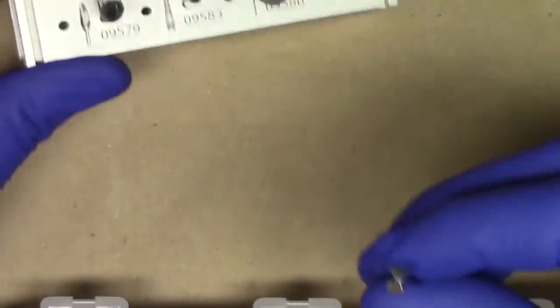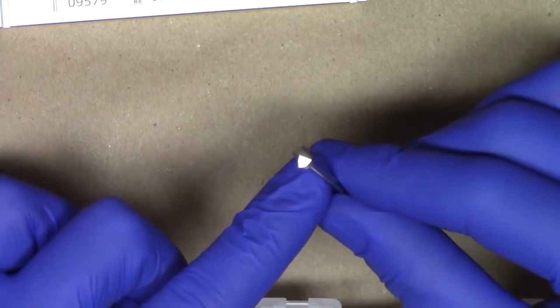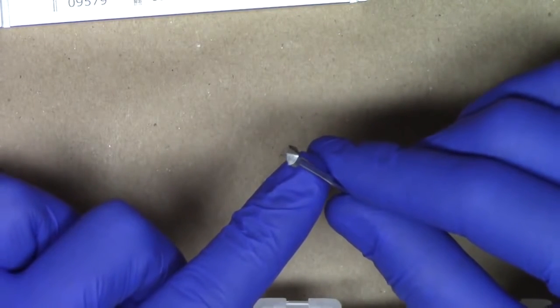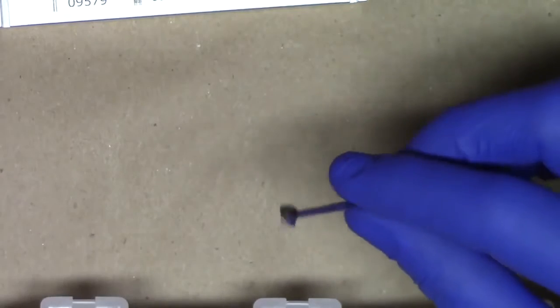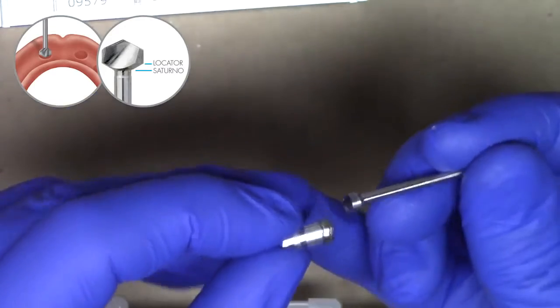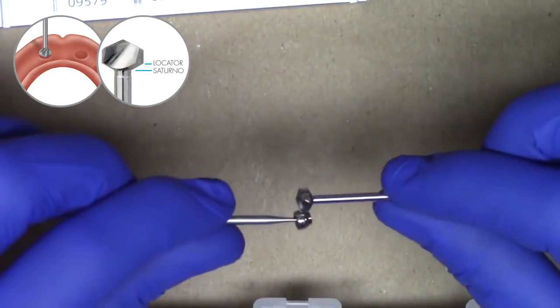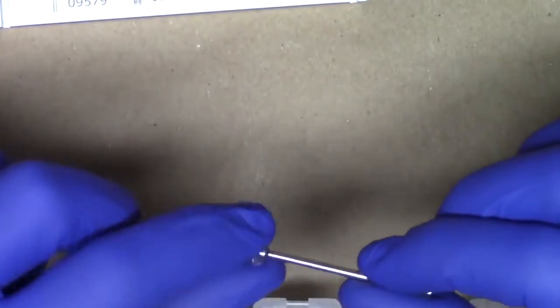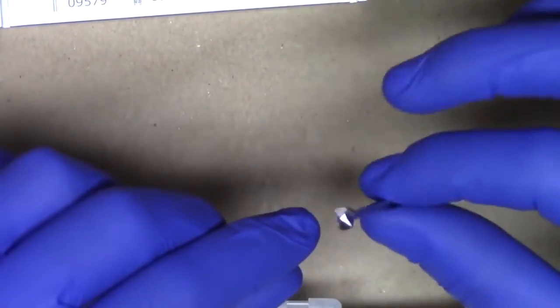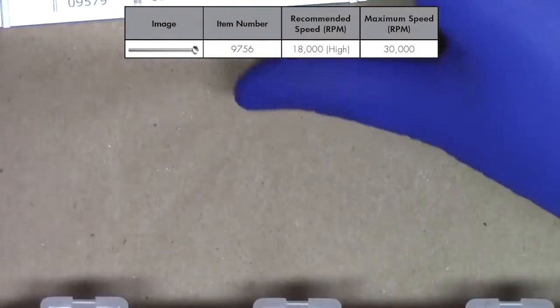First and foremost, this unique burr called the chairside recess burr is the first thing that should grab your eye. This burr is specifically designed by Zest Anchors so that you can quickly and easily prepare the exact size recess for the locator and Saturno denture caps. As you see here, pulling out a locator denture cap on this analog, it is perfectly sized so that you can very easily insert that recessed burr into the complete denture, preparing a hole that will match either that or the Saturno denture cap. It's really uniquely designed — just insert vertically and pull out vertically in a very straightforward gentle motion. The recess burr is meant to be used at high speed in a straight laboratory handpiece or with a nose cone in your operatory, at a recommended RPM of 18,000.